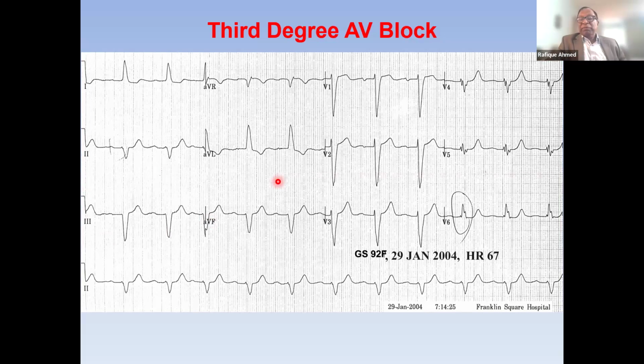Okay. A young person comes in with syncope. It can be vasovagal syncope. And I do a Holter and find a nighttime pause. I'm not talking about a daytime pause. Even when I find a daytime pause, I talk to the patient. Like the other day I saw a patient with a pause of 6 seconds at 9:30 in the morning. The patient had no symptoms. The loop recorder was put in for paroxysmal atrial fibrillation.